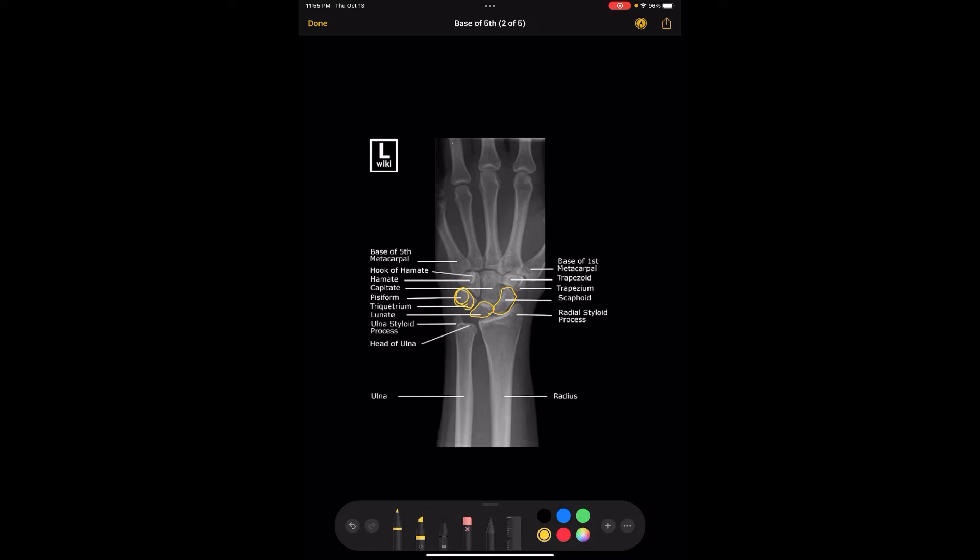And then if you go over here to the other side, right here is the trapezium, this one right here is the trapezoid, this one right here is the capitate, and this one right here is the hamate. And right here is the hook of hamate. So that's what you are supposed to see on every single PA wrist X-ray.